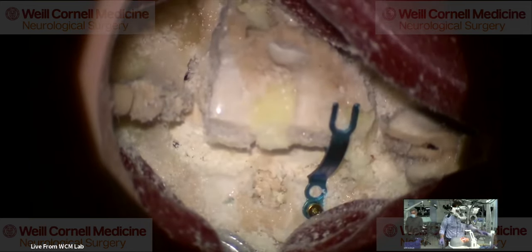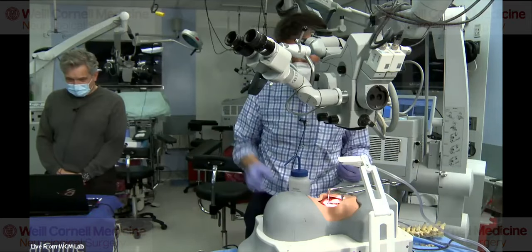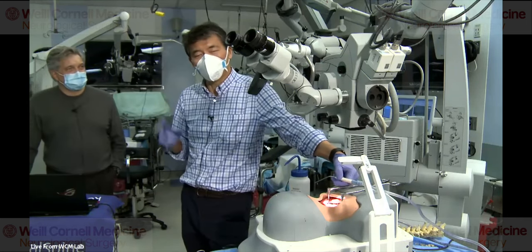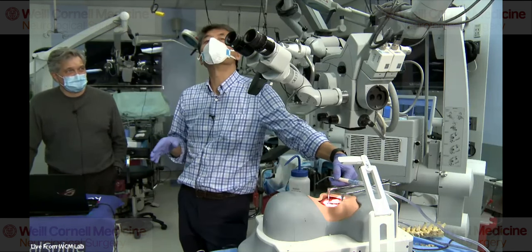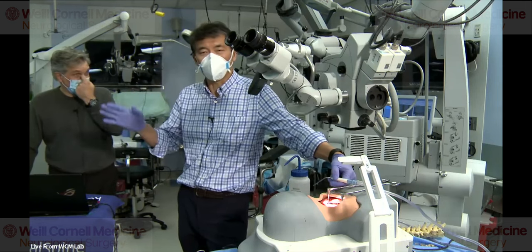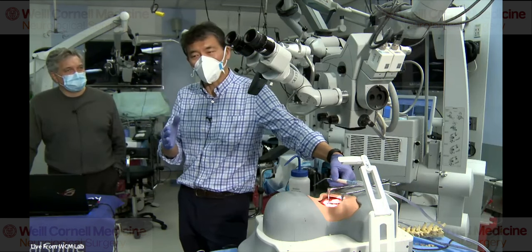Now, the final thing you got to do though, what is the most common complication of a laminoplasty? And everybody gets that wrong. Everybody thinks, oh, it's a C5 palsy. Wrong. The number one complication of laminoplasty is loss of extension motion. Why? Because people don't sew the extensor muscles carefully enough and the muscles dehisce to the side and you have an ugly looking incision. That's why you got to put in like 150 sutures to bring the muscles together.